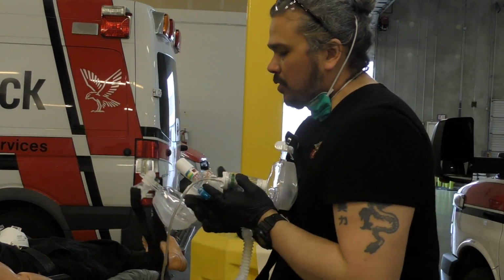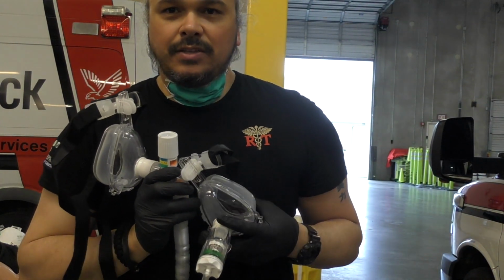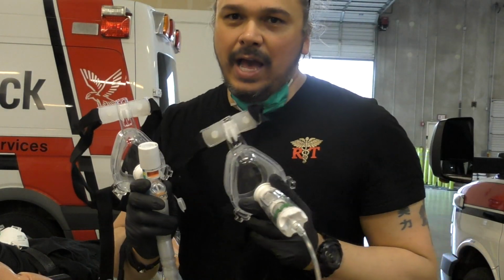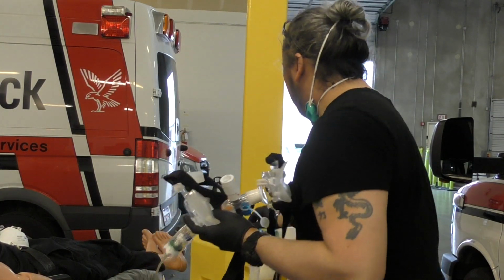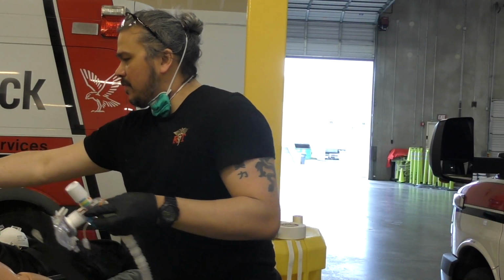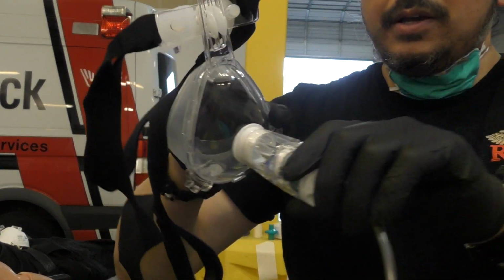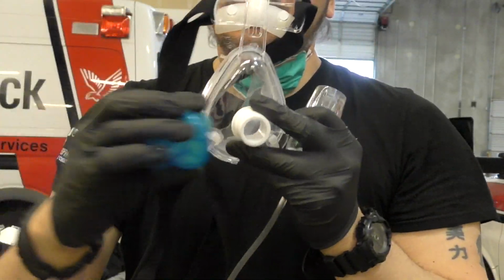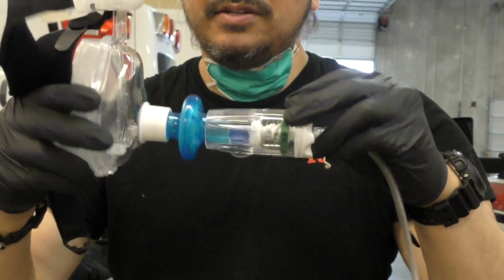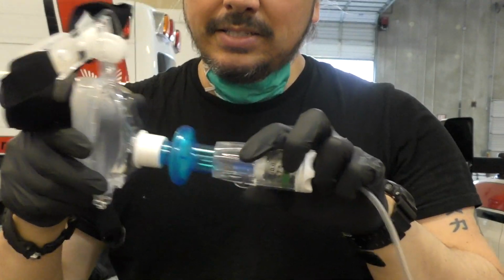Right now, both of these companies are working on a filter for that, just for COVID-19. They're just not ready, and they'll probably be ready any second, but in the meantime, we could do a hack, and we could put one of these filters on, okay? So currently, if you're going to put your patient on one of these, this apparatus comes off and you would put the filter here, which fits on the mask, however, it does not fit on the apparatus. So we've got to make this fatter, basically. We've got to make it so it stays, okay?